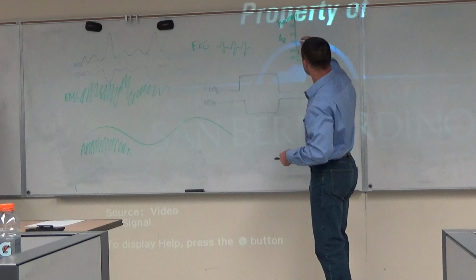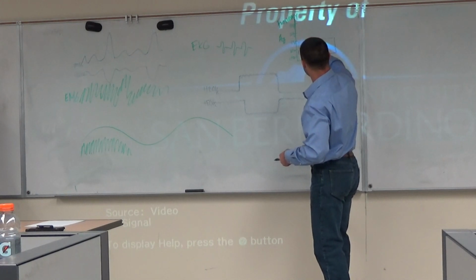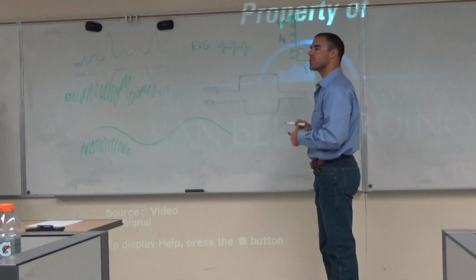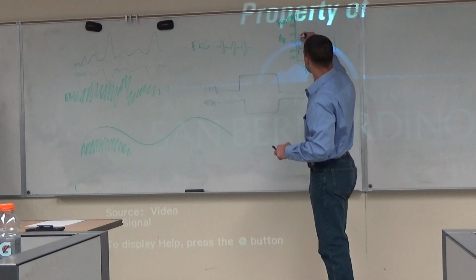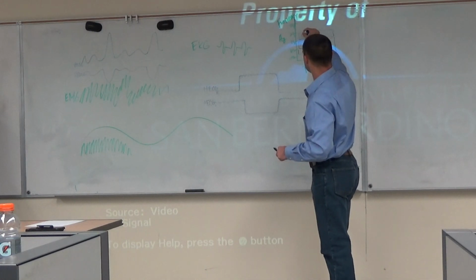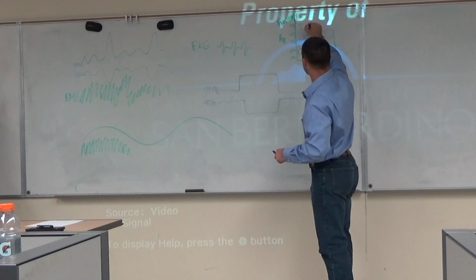Okay, now to your question, what is alpha? It tends to be about this frequency, about 8 to 12 hertz. You come up a little higher, say about 12 to 20, that's beta. And as you get higher, you're going to have gamma.